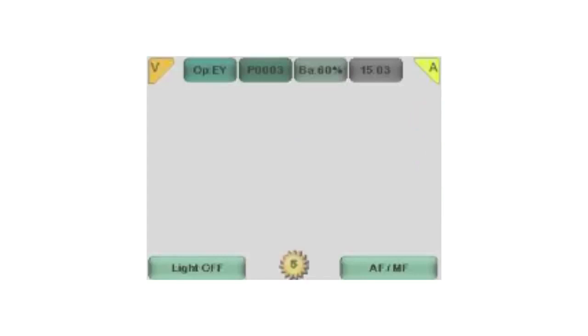If autofocus is used, there is no need to adjust the focus. However, the camera is slightly more sensitive to movement in the patient's eye and the stability of the user's hand. For this reason, it is slightly easier to start practicing with manual focus.